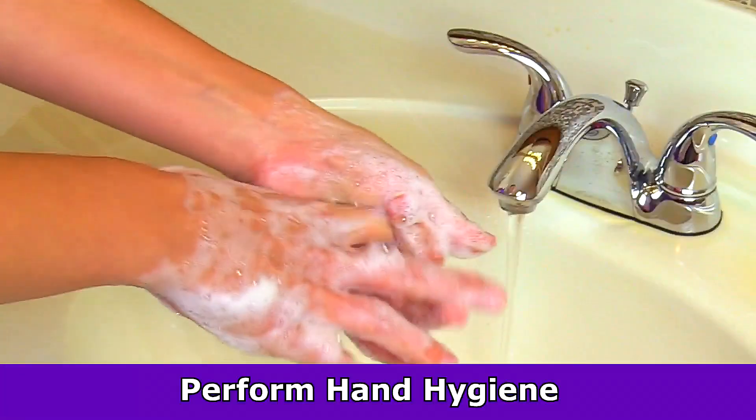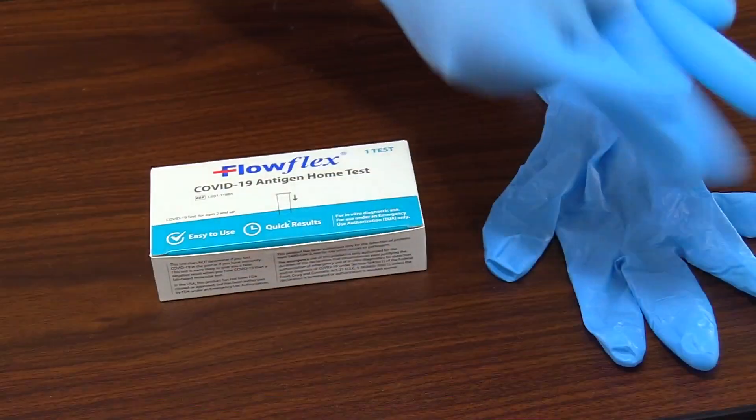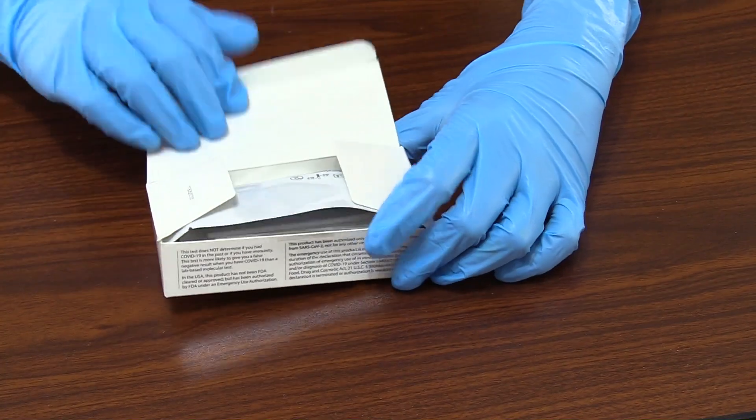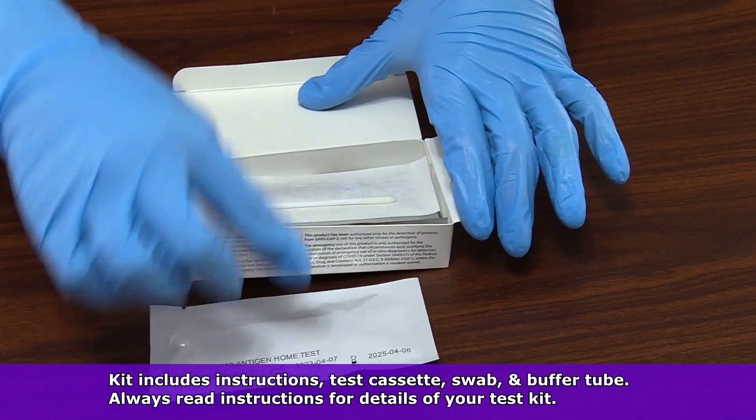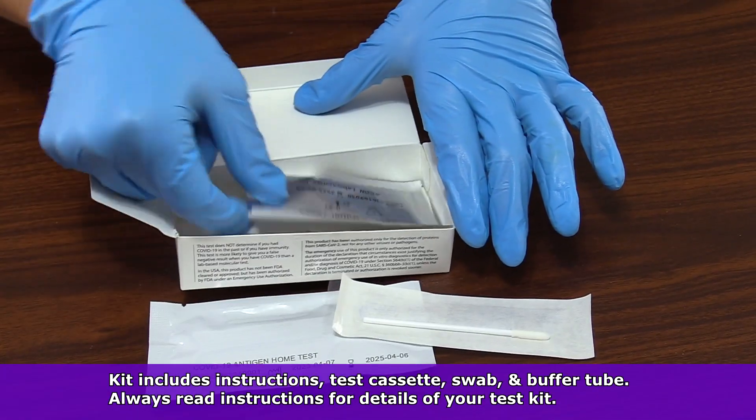First, you want to wash your hands. And if you're performing this test on someone else, you'll want to put on gloves, then open up your kit. And in the kit, you should find a test cassette, a disposable nasal swab, and an extraction buffer tube.